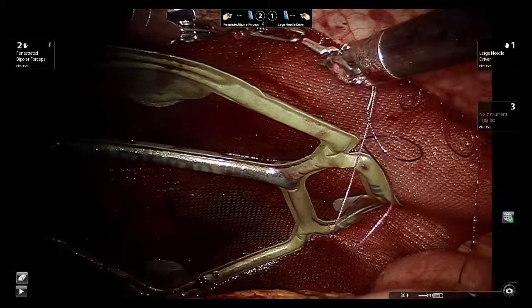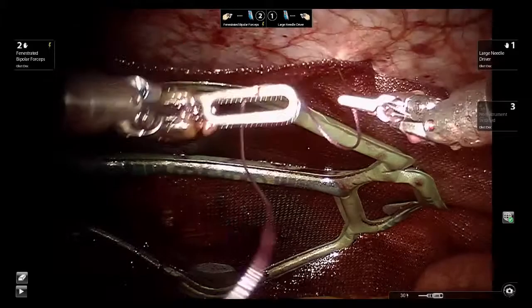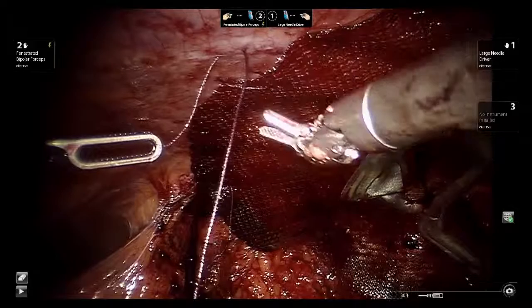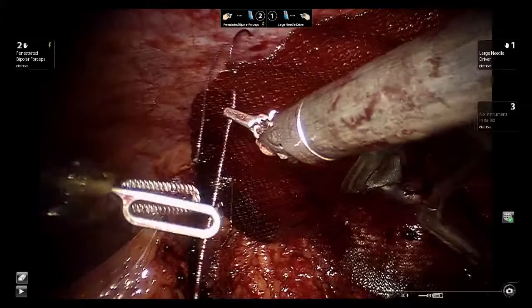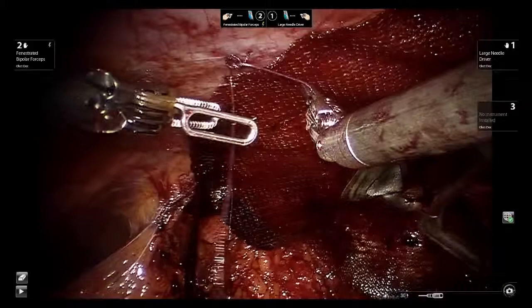After placing a couple of throws, one can go ahead and cinch up the mesh, and here you can see that the mesh is sitting nicely without being bunched up. The two sutures from the two ends are brought together and tied. We are now looking at the completed repair.